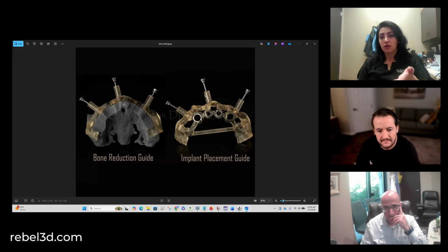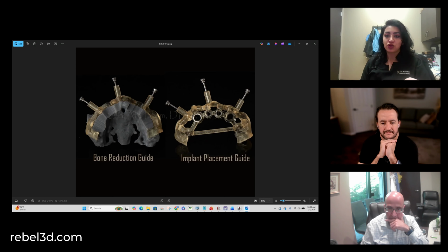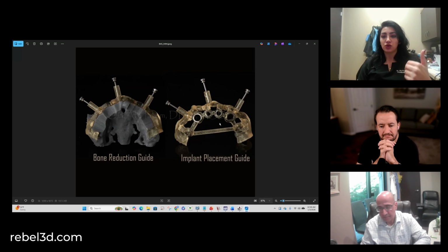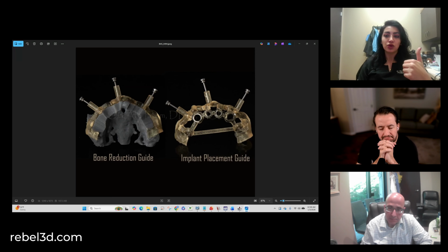The osteotomy guide comes with more problems as well. The sleeves that you're bonding in here could come out during surgery. There are so many issues, some breakage that could happen. No matter how much you try to stabilize the guide to prevent flexure, here we connected those last two guide tube holes with resin that's actually coming in the way of the palatal flap. Still, that could come in the way of visualizing if the guide is fully seated during surgery. Yes, you are creating some windows, which will actually add to the weakness of the guide in this case.